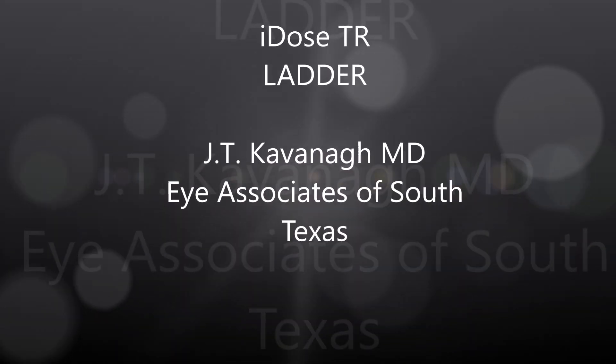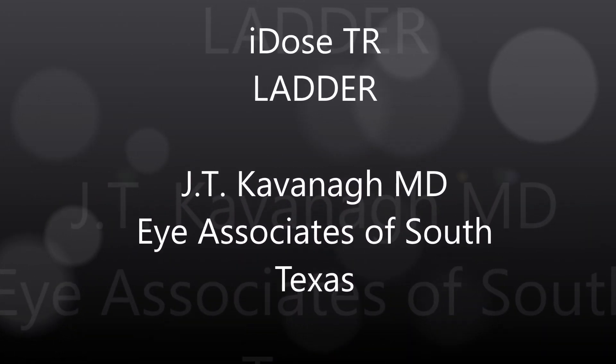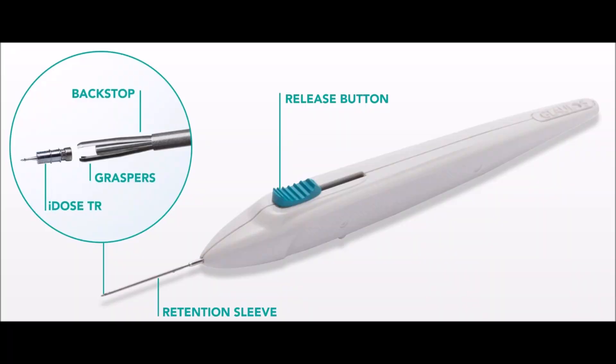This is Dr. Kavanagh of Eye Associates of South Texas. I'm going to show you an IDOS-TR implantation using the new LADDER acronym.